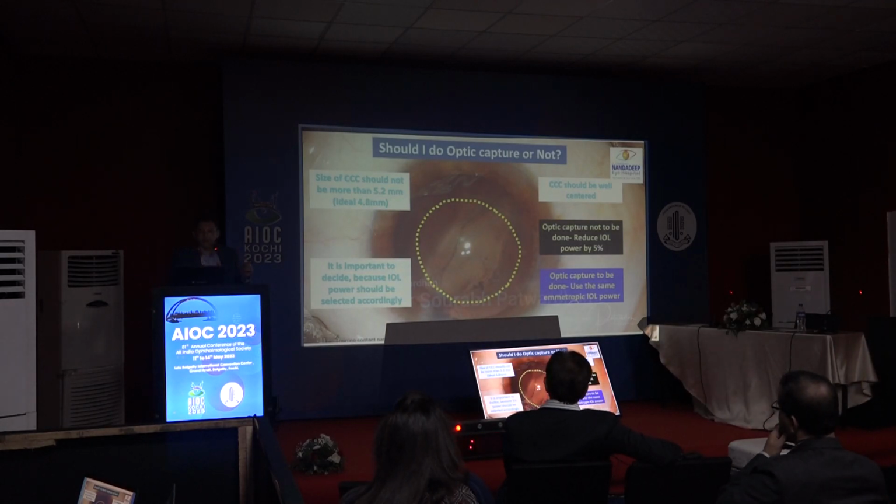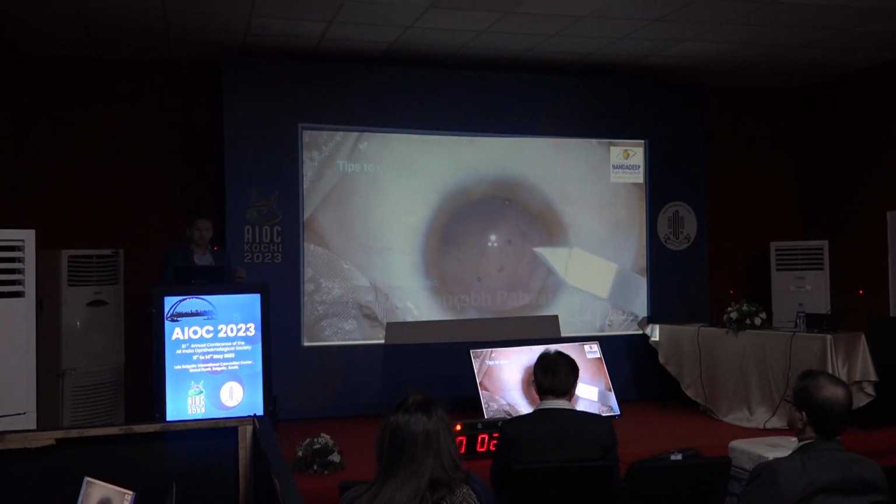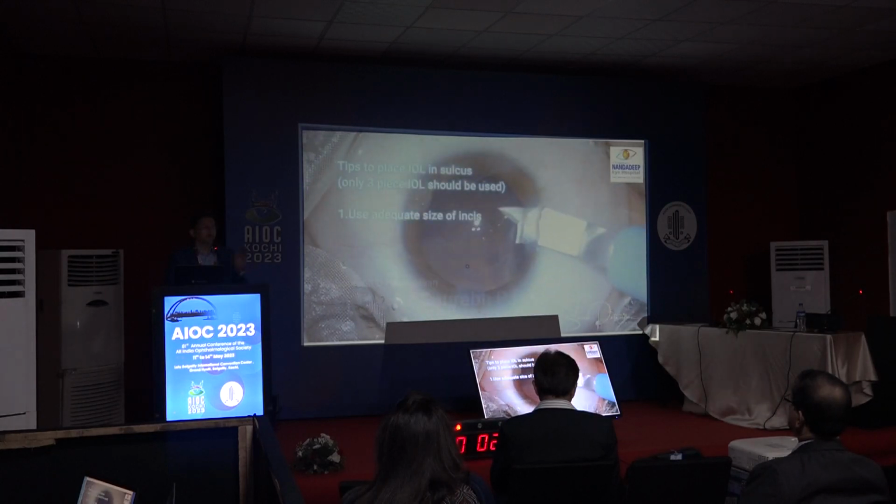So again, if optic capture is to be done, use the same emmetropic IOL power. It will give you the best result. Okay, now this is a technique to show the optic capture being done.